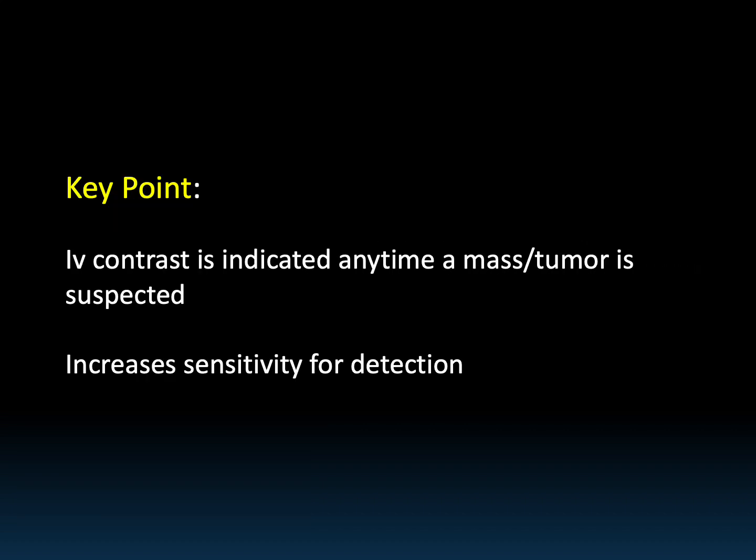The key point is that IV contrast is indicated any time that a mass, a tumor, any kind of lesion is suspected because it increases the sensitivity for detecting these by increasing the difference in attenuation between the suspected pathology and normal structures.